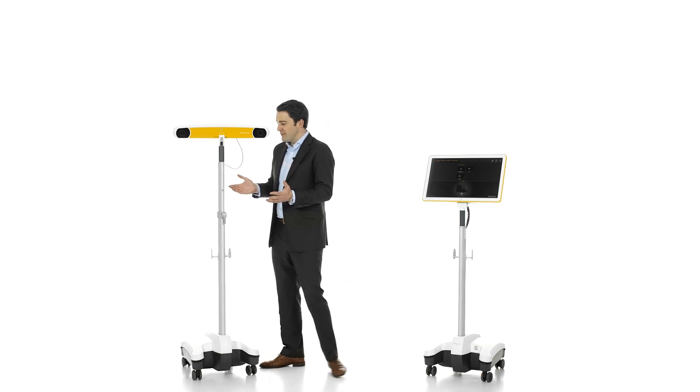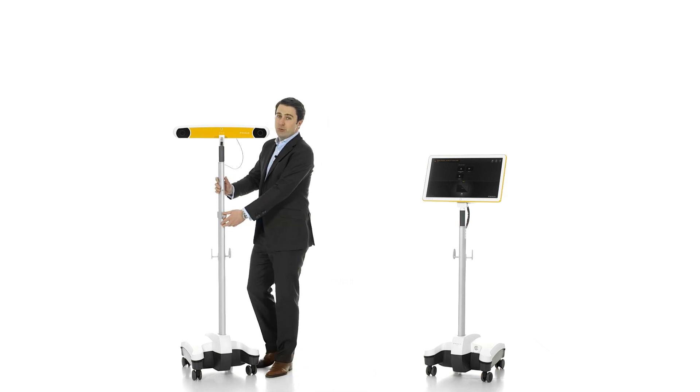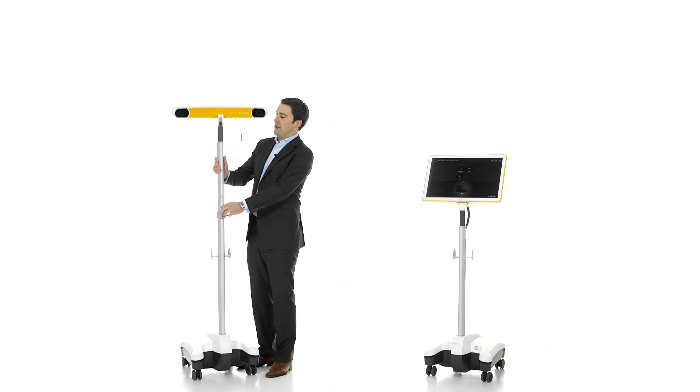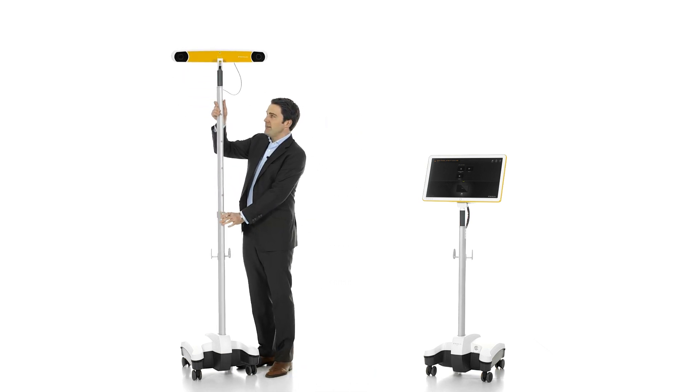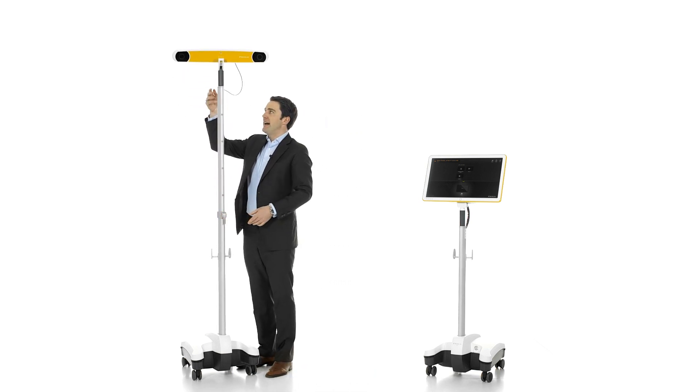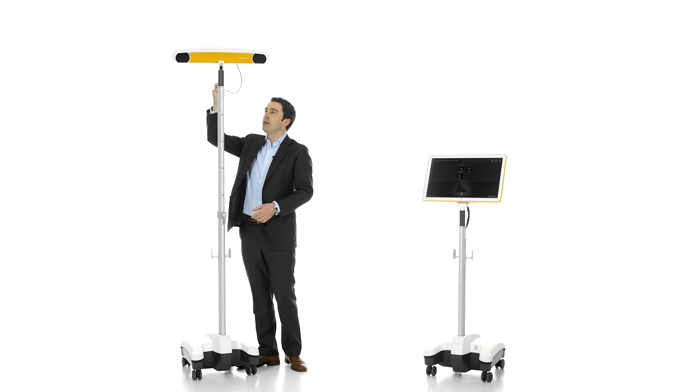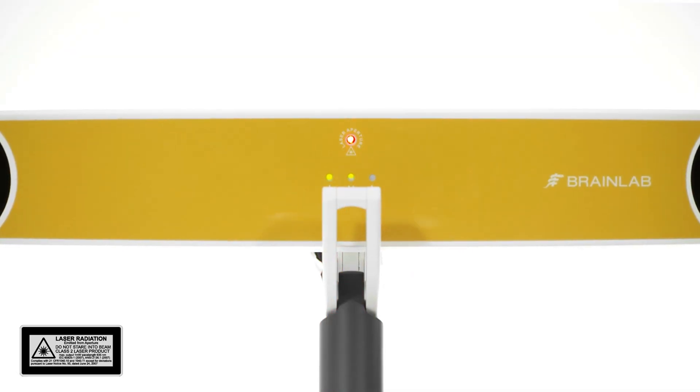The KIK camera stand is easily moved, adjusted to height, and set up with its positioning laser.